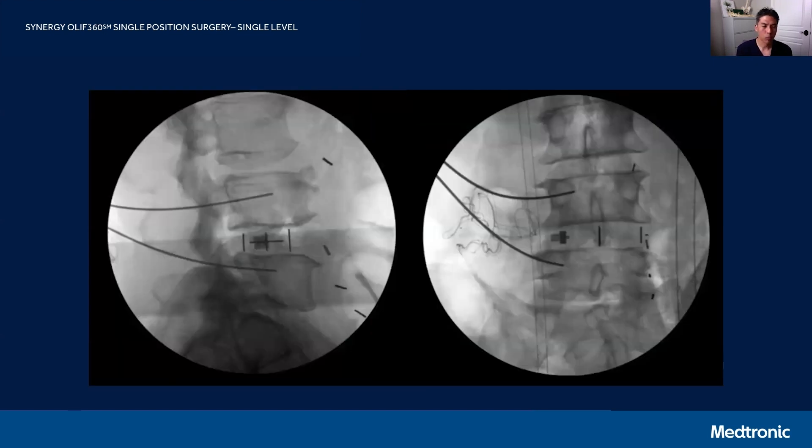For my typical single-position workflow for single-level fusions, the patient is positioned on the table, prepped and draped. We do an O-arm spin, and the first thing I do is cannulate the pedicles. I prefer to use a navigated Midas burr — I use a pilot hole, cannulate the pedicles, and then place a wire into each of the pedicles.